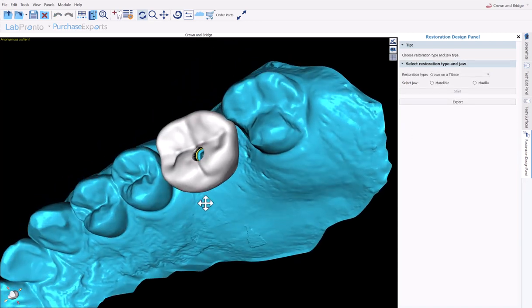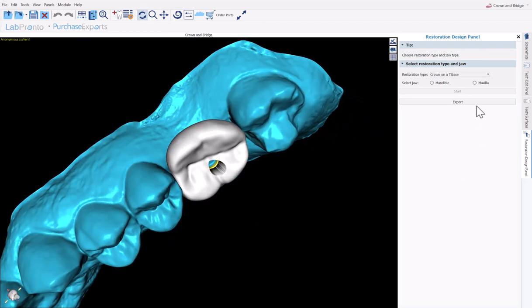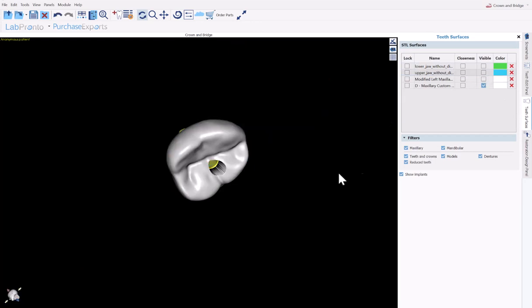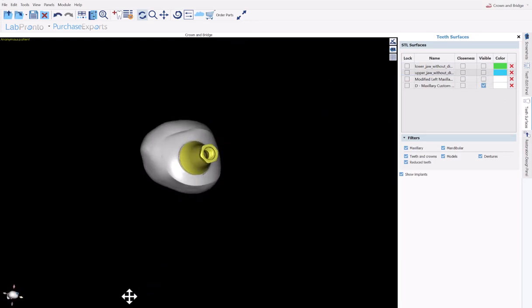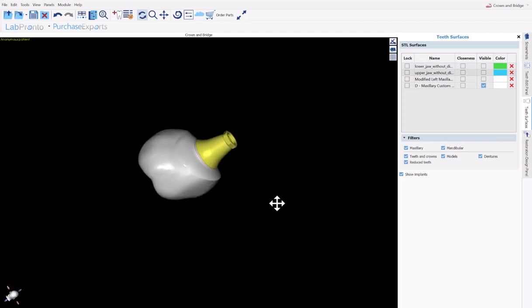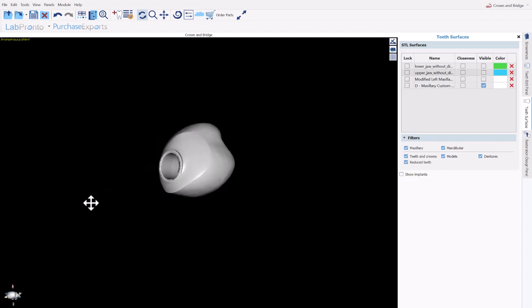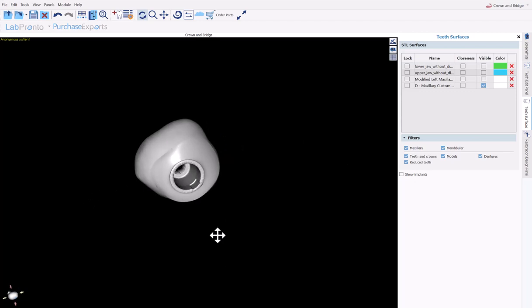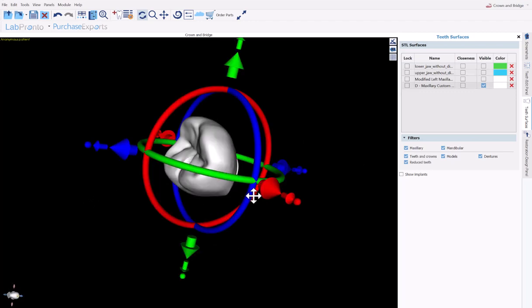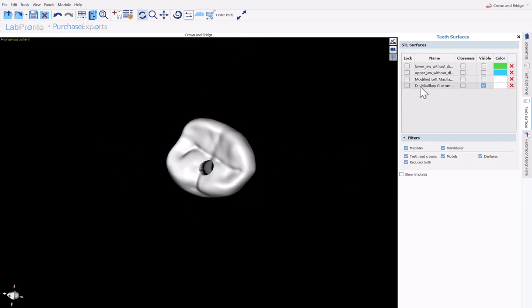We can now see our completed crown. Before we go to exports, let's just take a look at our surfaces. Let's toggle off the model. And here we see the crown designed for the tie-base with the anti-rotation. On our surface list, the surface that appears with the D indicates that it is a design surface. And here the design surface, we have created the crown.